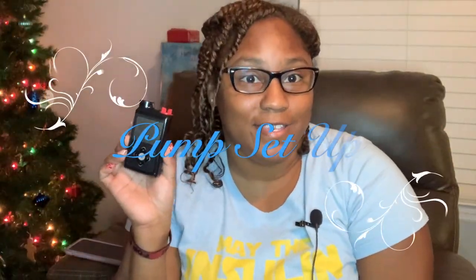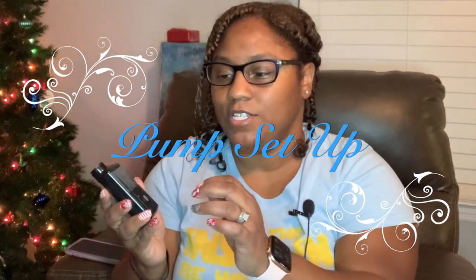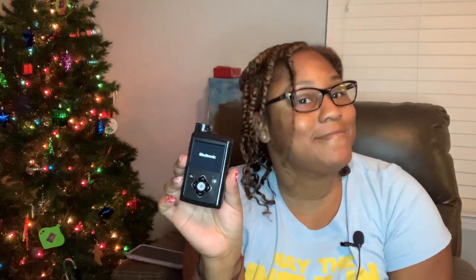So I'm going to go ahead and get this started. This is the 770G pump. Removing the tape and removing the little insert here — this is just where your reservoir goes. I'm going to go ahead and insert the battery. Get the clip out. You use the tip of the clip to screw on the battery cap. Push in.